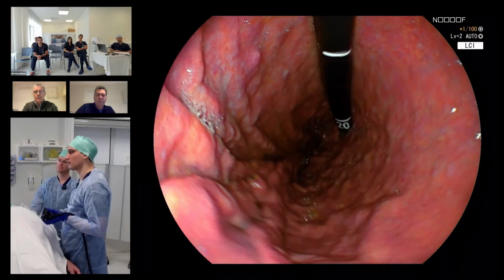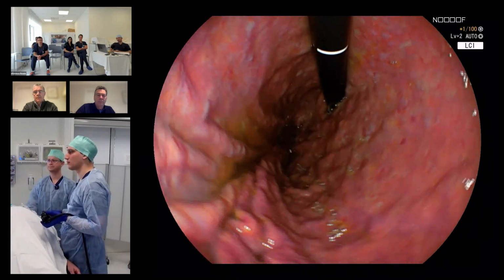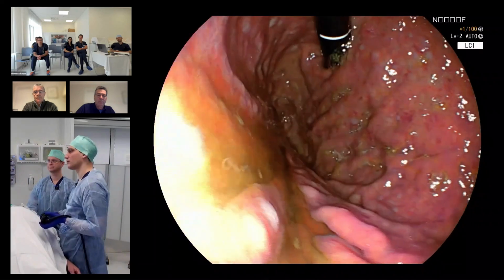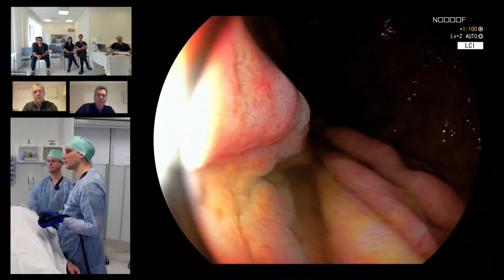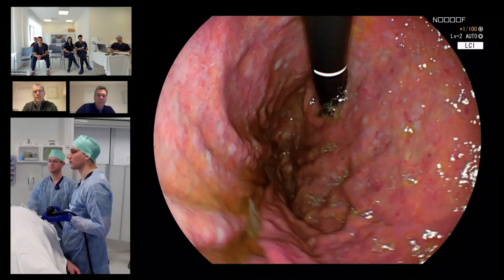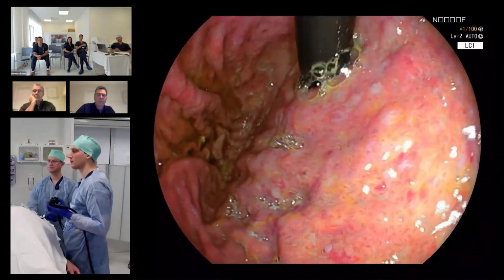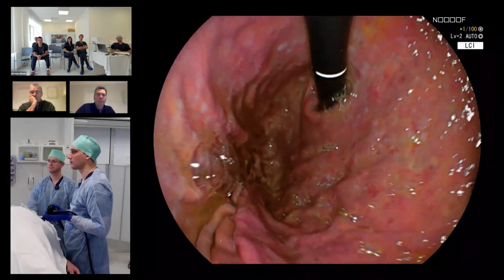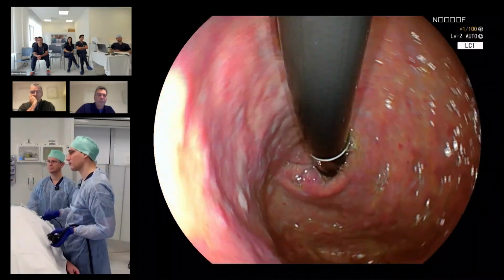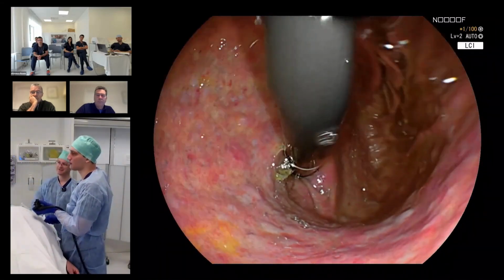And I think it is excellent. I think it does draw lesions out. So maybe we can use this mode to examine the proximal stomach. So you have to do what we did yesterday. You really have to expand the proximal stomach, and that means sitting on the CO2 button. And while you're doing that, you can make an assessment of the sphincter competency there. We have to look at the palisade vessels also for every case. Remember the palisade vessels when we have the cap on later?